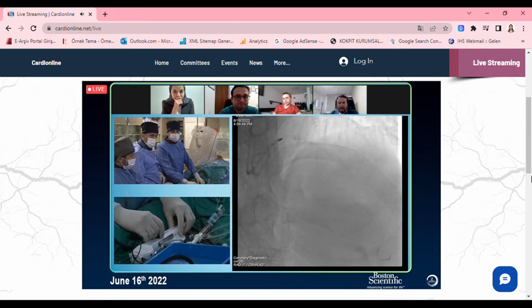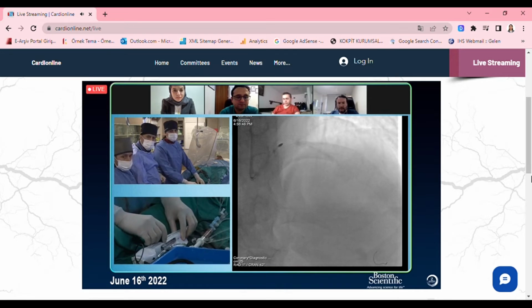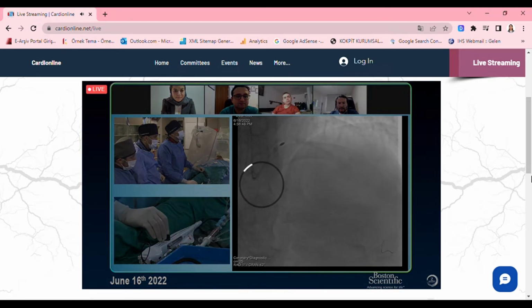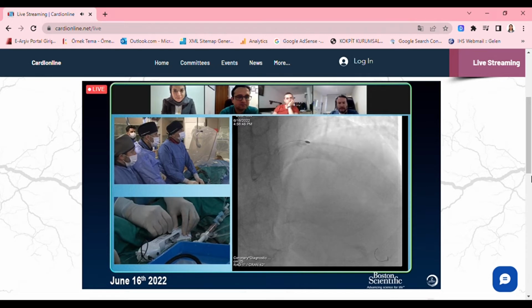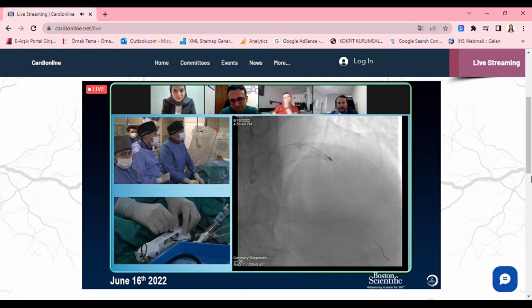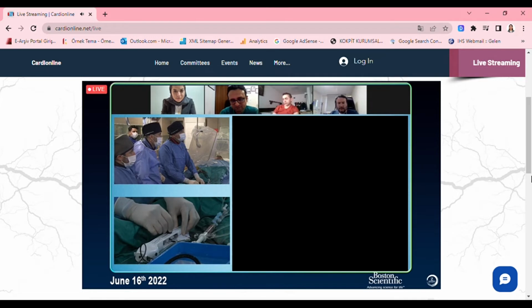Are we ready? Yes. All right, let's start. Dynaglide off. So we have to push gently. Now I don't have any resistance so far. I have some resistance here. If I have light resistance, I can push forward.